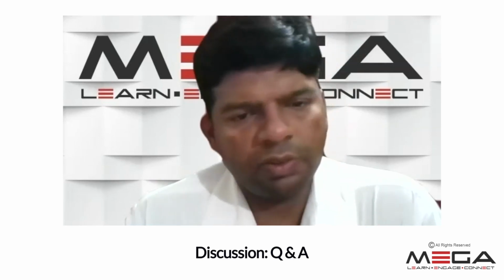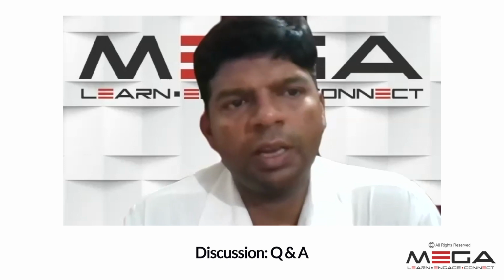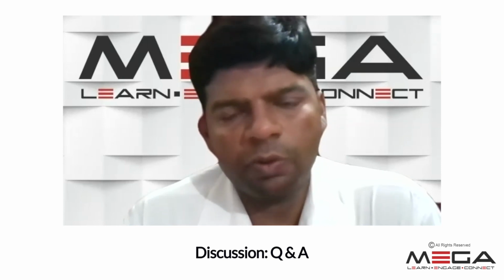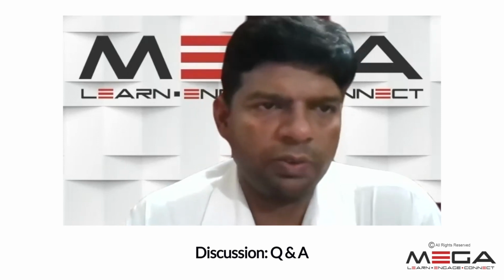So we should not confuse bilevel and biphasic positive airway pressure. One is through the NIV, where we set the IPAP level and EPAP level, and the other is just like the APRV mode, where the patient is able to take spontaneous breaths in both the high pressure and the low pressure.